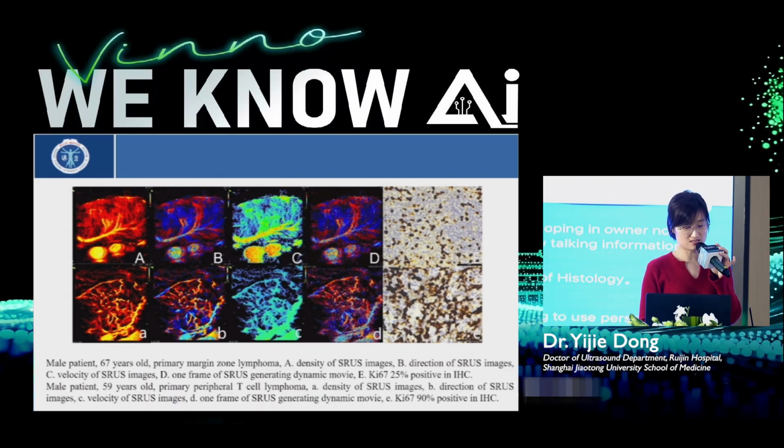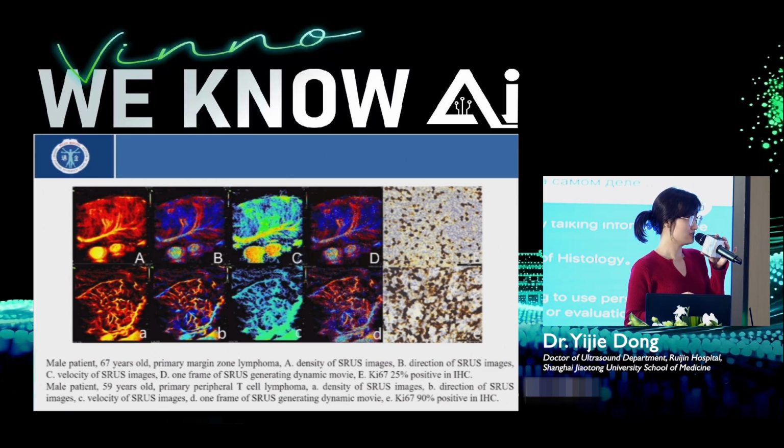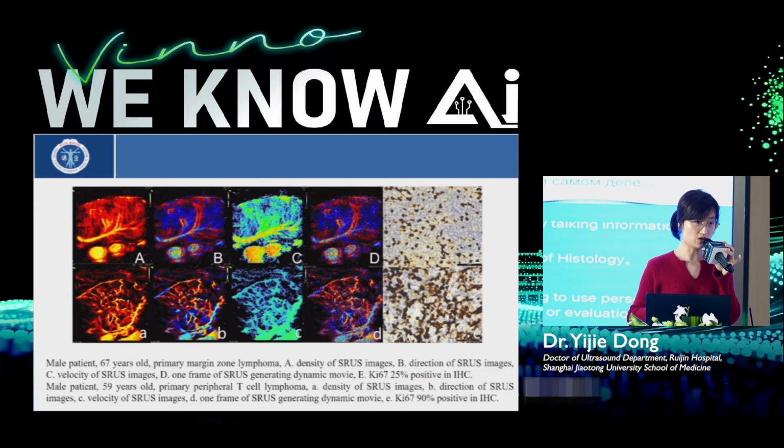The histology results told us this patient has a lower Ki-67 proliferation expression. That means this patient is not so serious.